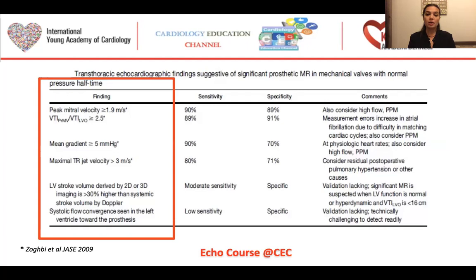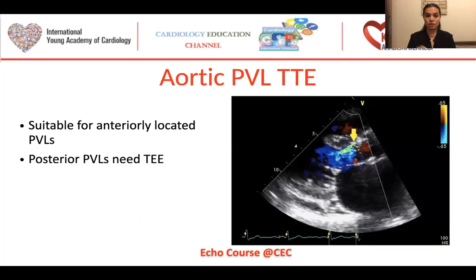All of them are indirect signs of PVL. So when we are suspicious about the PVL, we should go with transesophageal echocardiography.